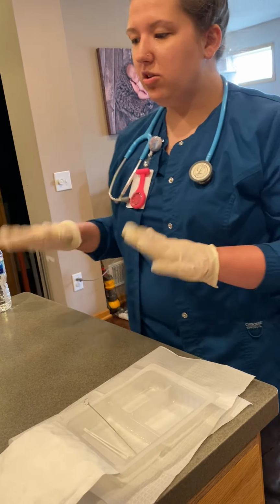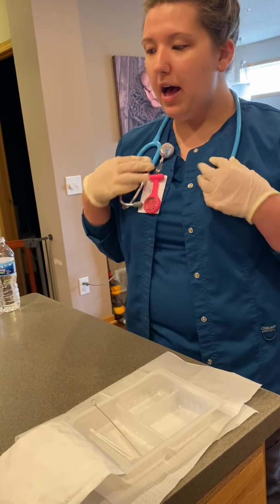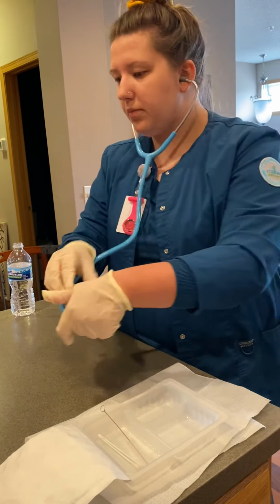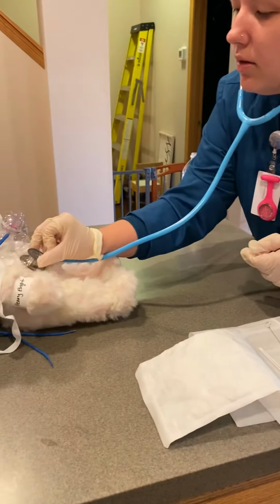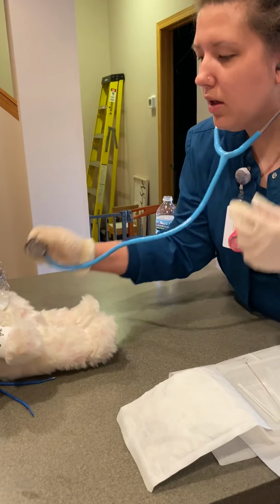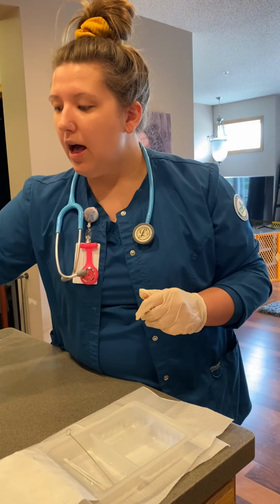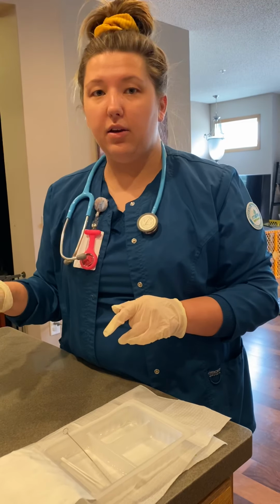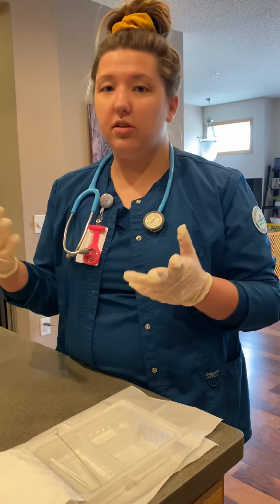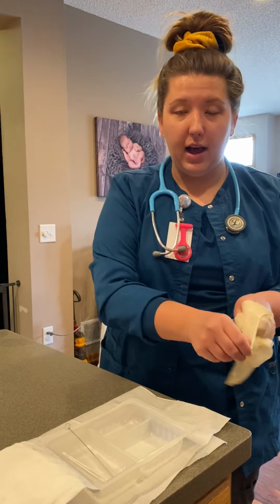And now I'm going to do an additional assessment to see if there's more need for suction at this point. I'm going to take another listen to the breath sounds. Listening to the lungs. Okay, I would do my oxygen saturation, feel for the pulse. I would monitor for signs of cyanosis and see if there's any change in the condition, so restlessness, things like that. Then I'm going to take off my gloves and provide hand hygiene.